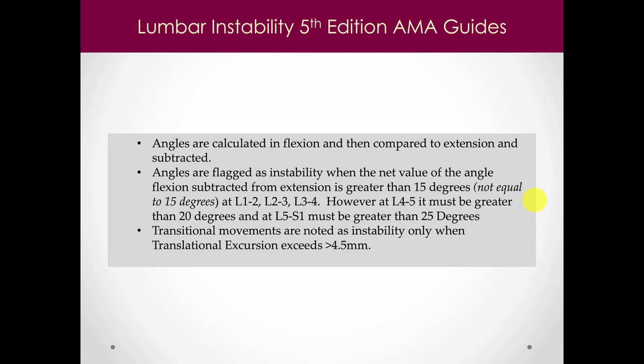That's one of the reasons why in other systems, like with using posterior tangents, an angle is an angle, and we measure it the same way regardless of how the spine is done. Unfortunately, there is not an instability assessment for posterior tangent method for the lumbar spine at this time, but maybe shortly some more research will come out on that.